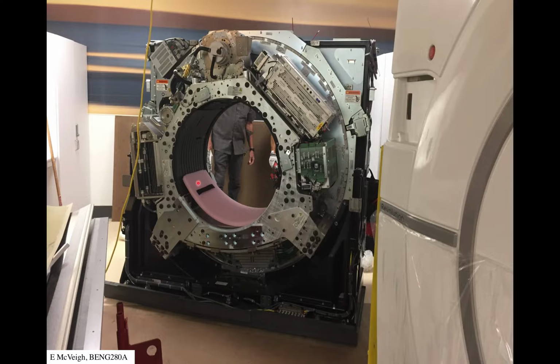That's what it looks like being installed. This was ours. We got this delivered about 2.5, 3 years ago, something like that. And so here's the gear. It's just like watching the techs, the field engineers, put this together. It's just like IKEA on steroids, right? I mean, they have these huge volume books, and they have to bring out these parts and clamp them together to within certain tolerances and things like that. So it's actually amazing that they can mass produce these things and have them installed and they all work, because the mechanics of this thing is pretty impressive.